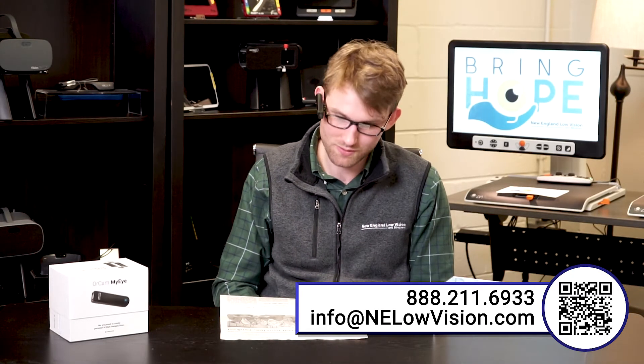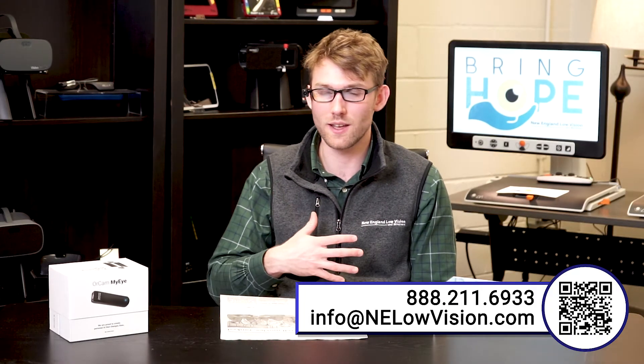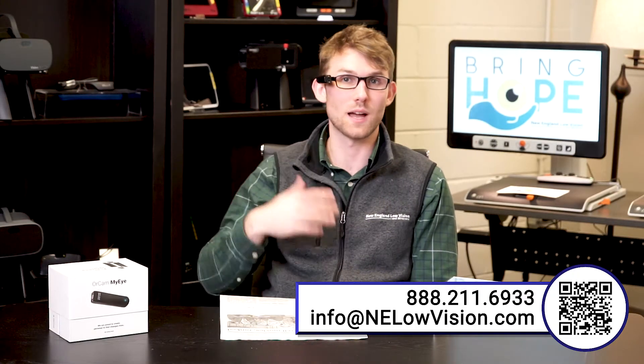It takes a picture and says "Ready." Now it's actively listening, and I say "read the headline" — it responds: "Found one headline. The 10 Best Will Ferrell Movies, Ranked." I then say "read everything" — it reads: "The 10 Best Will Ferrell Movies, Ranked. From Frank the Tank to Buddy the Elf, Will Ferrell has always found a way to make us laugh. In addition to having a key supporting role in the..." I use the stop gesture — putting your hand out — to stop the reading without any physical input into the device.